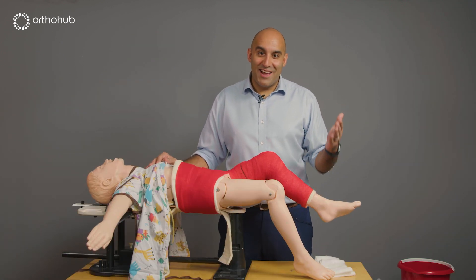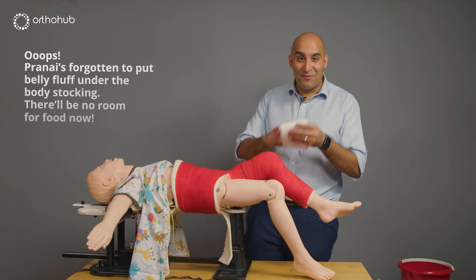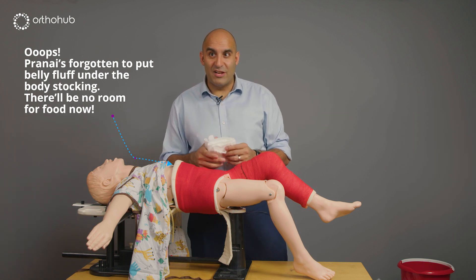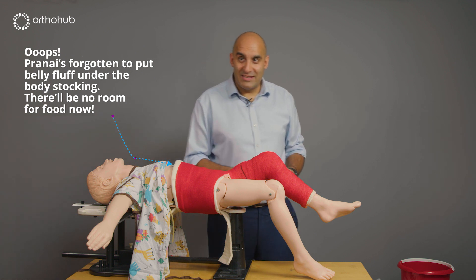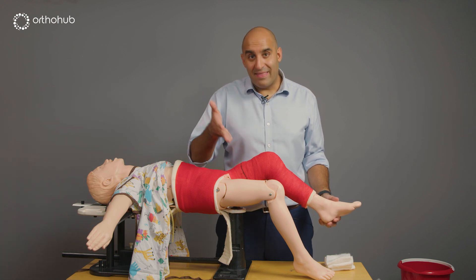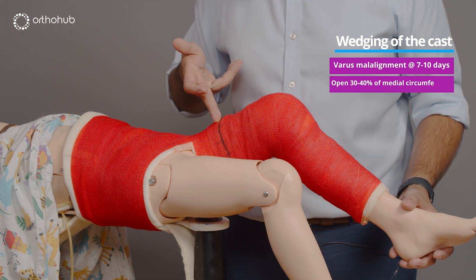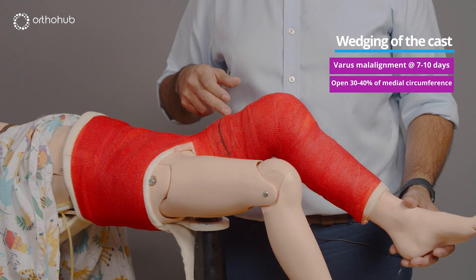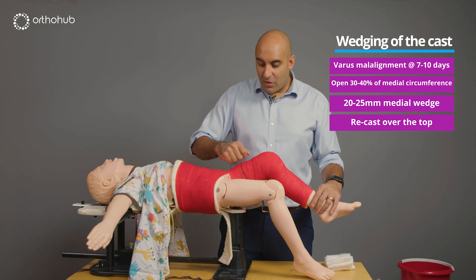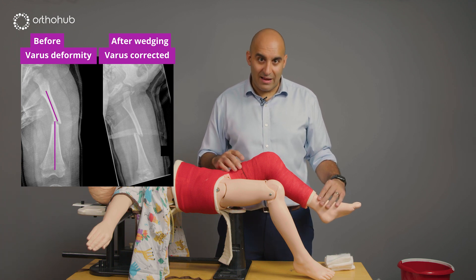After seeing colleagues' instructional videos I realised I had to make one mistake to feel part of the family — mine was forgetting the fluff that goes inside the tummy, which is applied when you put in the stockingette. Always remember to take it out at the end, or like me, remember to put it in at the start. If wedging is needed at the seven-day mark, open approximately 30 to 40 percent of the cast circumference, wedge using a 20-25mm plastic or cork wedge, reapply scotch cast or soft cast, take another X-ray, and confirm the angulation has been corrected.